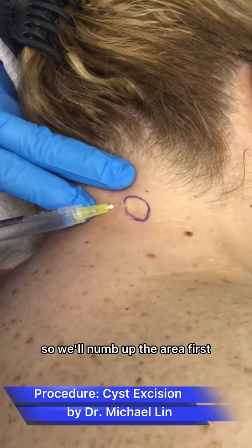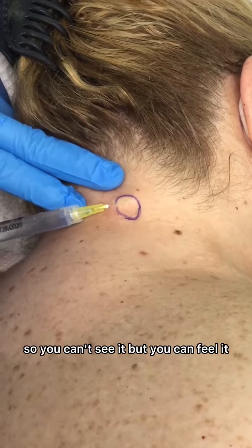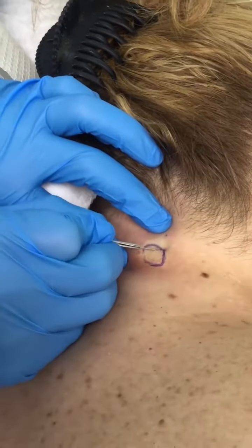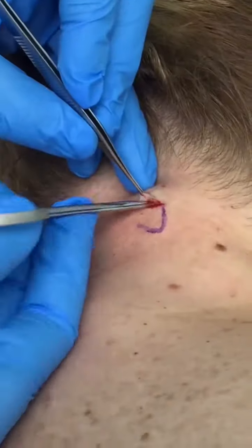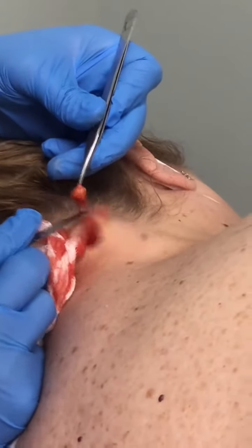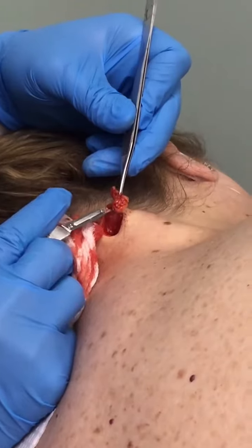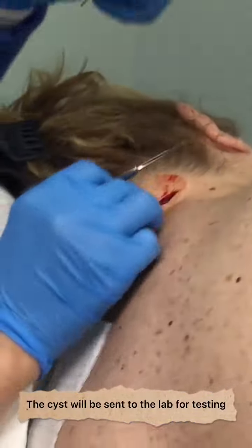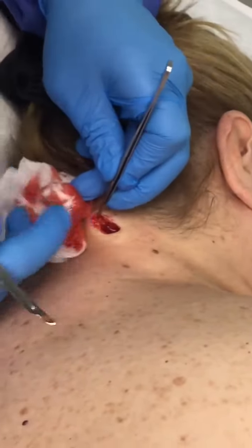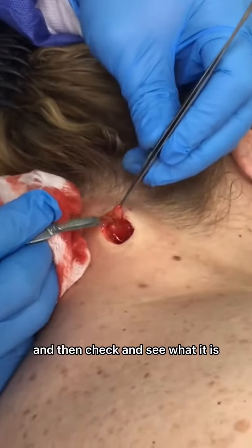We're going to do a little cyst excision. We'll numb up the area first and then we're going to remove it. This cyst is pretty deep under the skin, so you can't see it but you can feel it. We're going to send it to the lab and check it and see what it is.